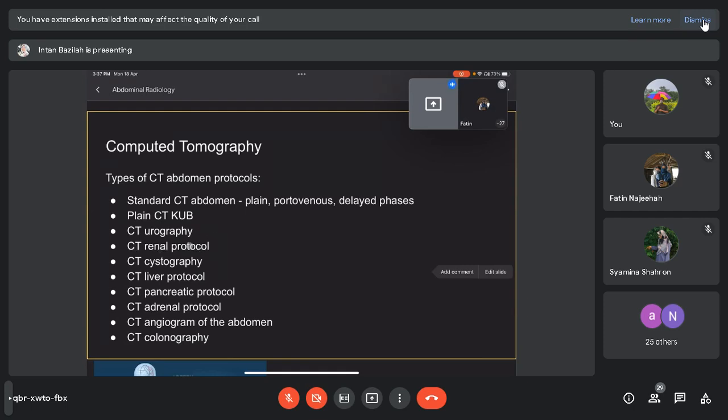This is the CT renal protocol, when they want to look for a renal mass. They want to characterize the renal mass, or when they want to look at the classification of a renal cyst. When we see a renal cyst on ultrasound, if it's complex, such as when there's presence of septation or calcification, they will proceed to CT renal protocol so that we can further classify if the patient is in high risk.